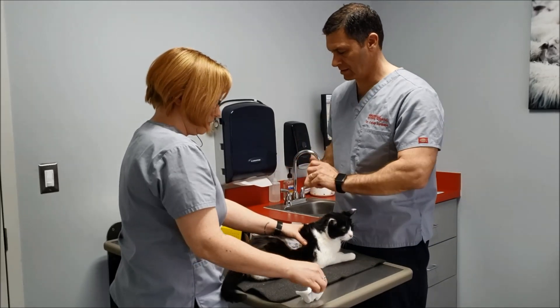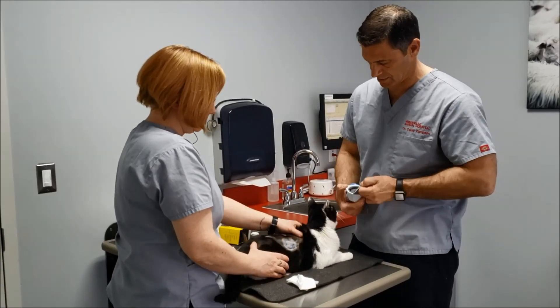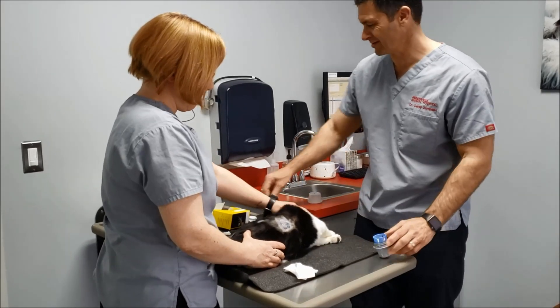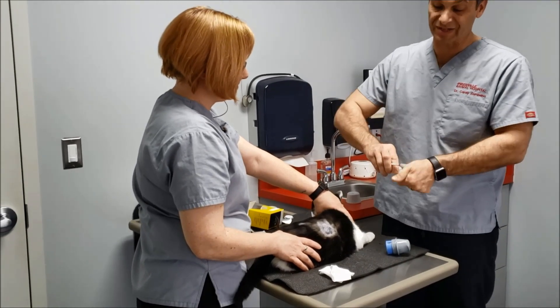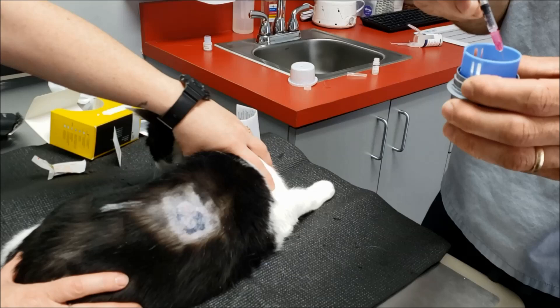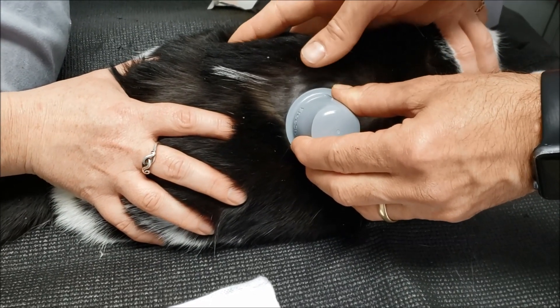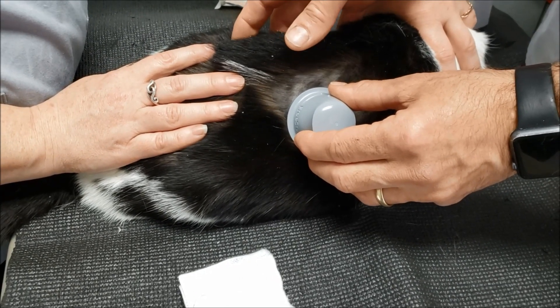Much like the other ones, you just load the applicator while she's hanging out — she's a cool cat. Just load it, take it out, and as always, I still like doing a little bit of tissue glue to help make sure it stays stuck. So I'm just going to go ahead and put a little tissue glue on this one, just to make sure. Just put it on the side and do a short break here, letting it adhere.